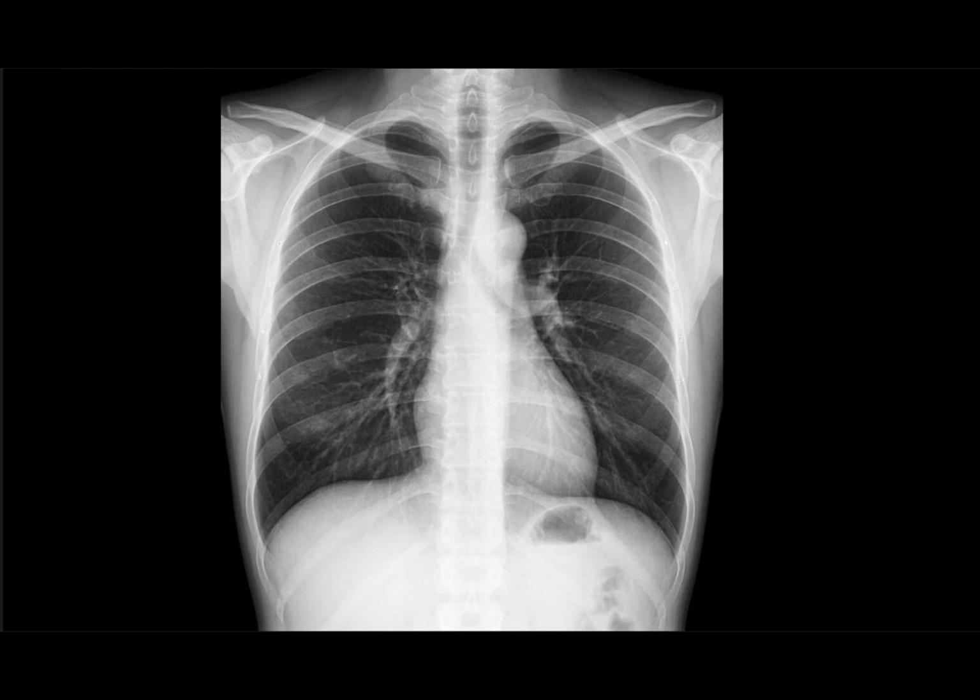This is a radiograph of the chest, commonly called chest X-ray. The chest X-ray is normally taken in three views: AP view, PA view, and lateral view.